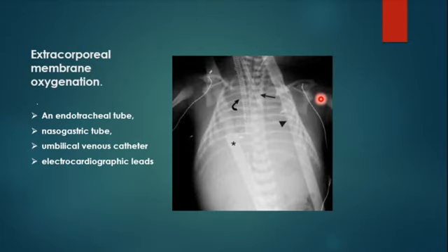Yes. So basically, it's like a lung, right? Yes, exactly. Just like hemodialysis. Exactly. Now, my question is how does blood return back through the artery? Yes, it's a very invasive procedure. It's just replacing, bypassing the lung, giving the lung time to rest.